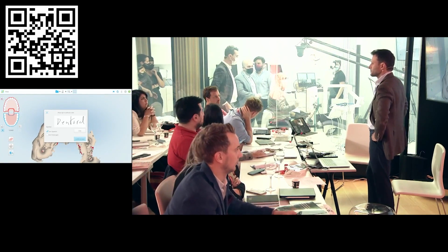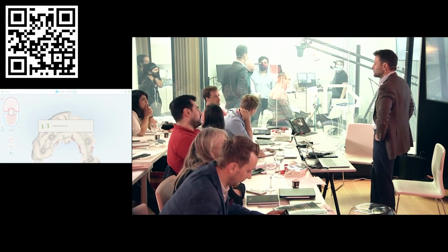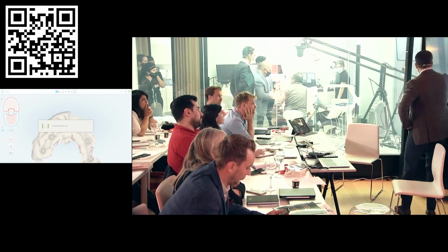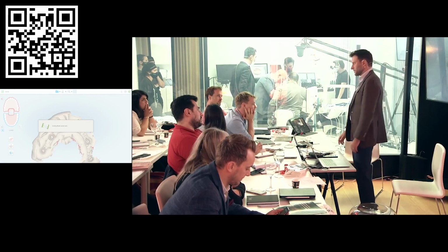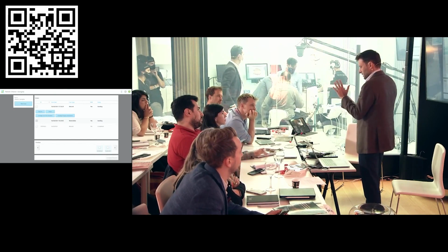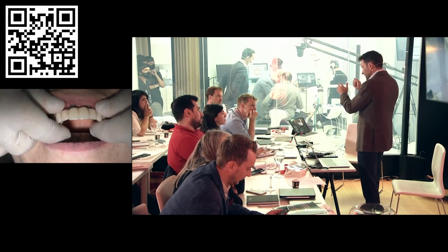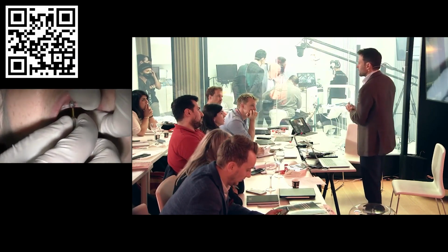Why not cut it between all the implants? That's the ideal. If it is not fitting, you cut in between all of them. Then fix it, scan it in the mouth, take it out, get it. I would do that most of the time, unless you're very clear that you know exactly there's one implant that is out for any reason. But yes, I think that's the safest to do.